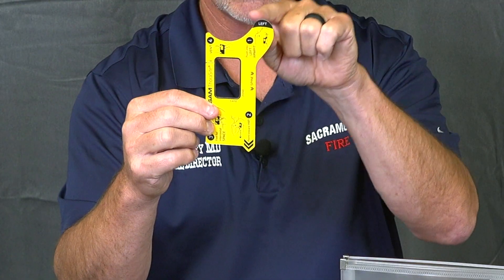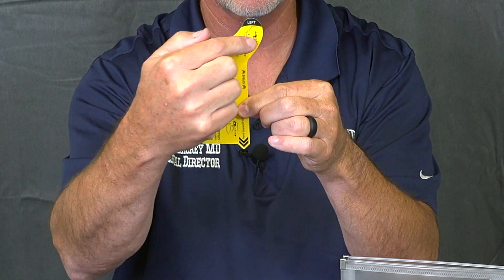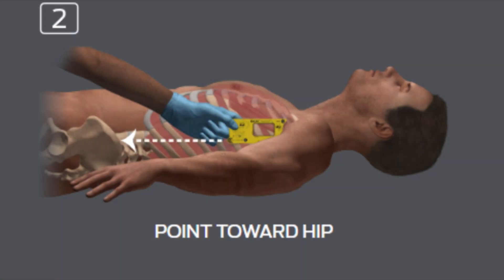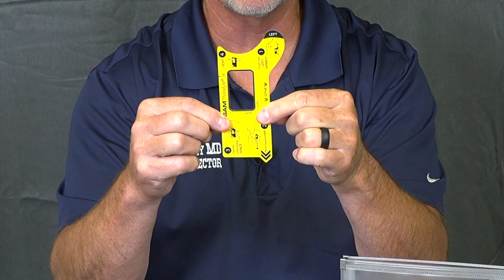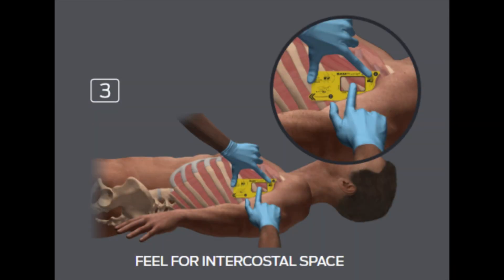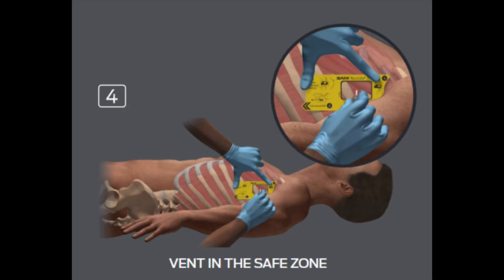This notch up here tucks up into the patient's axilla, and this side is toward the patient's front. So if this were the left side of the body, this would be in the left axilla, this would be up at the front, pointing toward the hip. And then you have this window right here — the window is where the needle goes. Once you have this tucked into the patient's axilla, you reach through the window and palpate for the intercostal space, then introduce the needle through the window into the intercostal space.